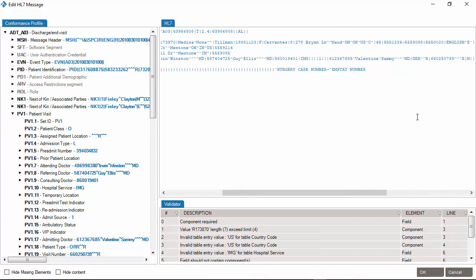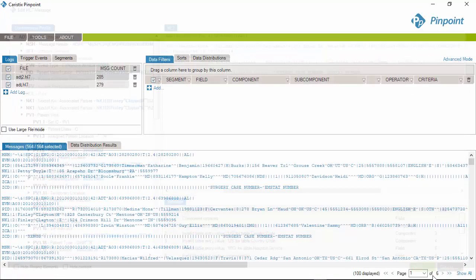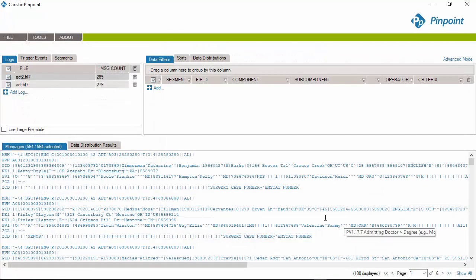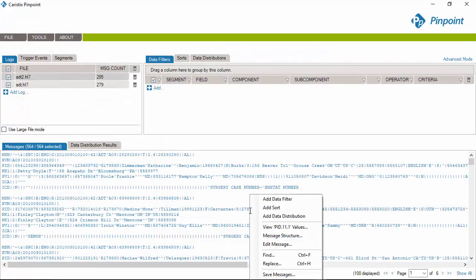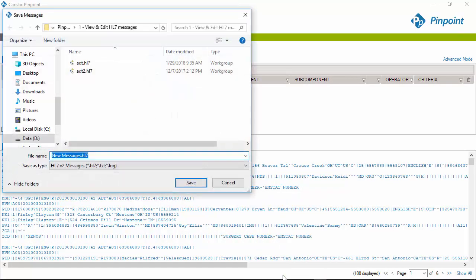Once you're done editing the message, confirm your change and save it in a new file. Right-click in the message area and select Save Messages. Now all you have to do is select where to store your new file.